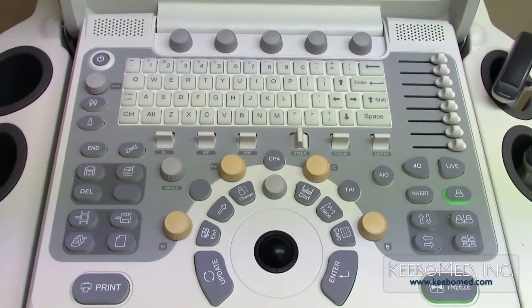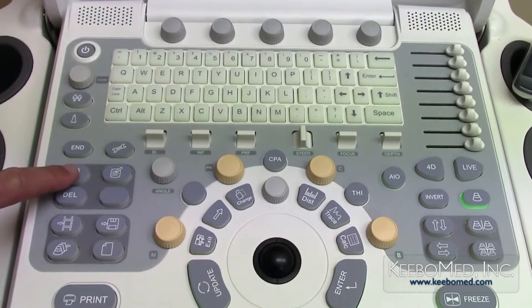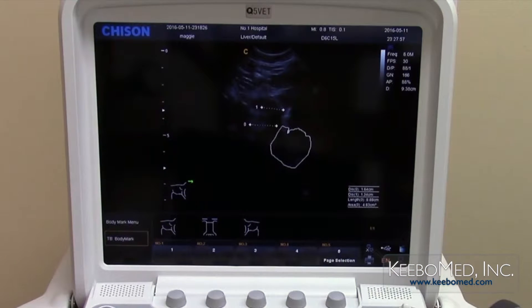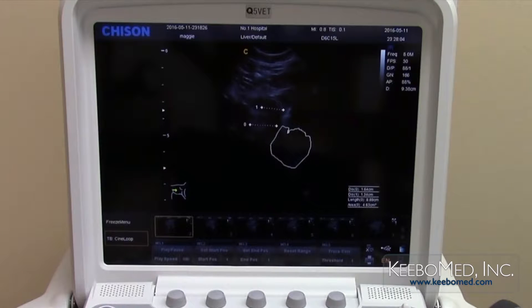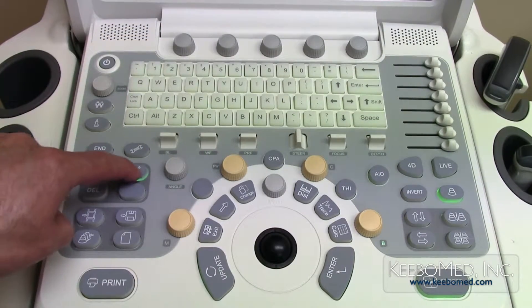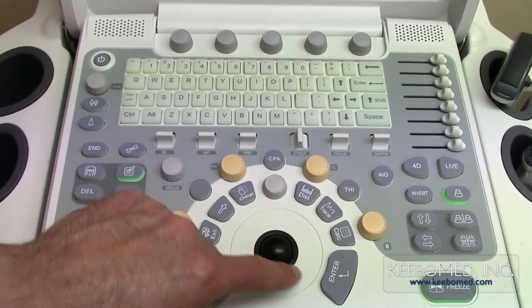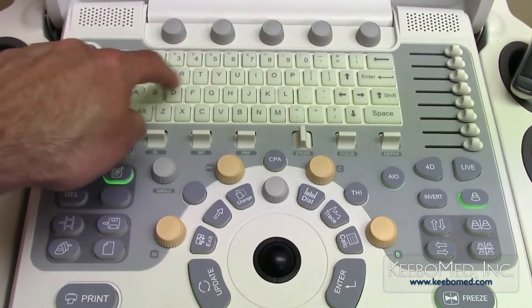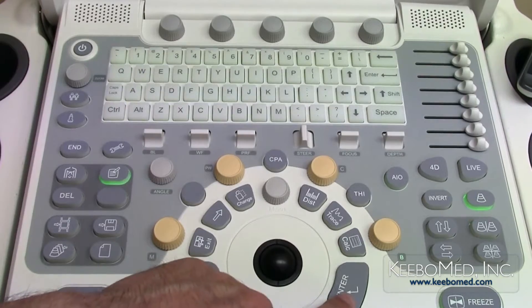To add a body mark to an image, press the body mark button. Different body marks are displayed on the bottom of the screen, numbered one through five depending on the type of examination. Select the appropriate mark by pressing one of the buttons at the top of the keyboard, then use the trackball to position it and press enter to confirm. Press the comment key and a cursor will appear; use the keyboard to enter comments and the trackball to move the comment to the desired area, then press enter to confirm.